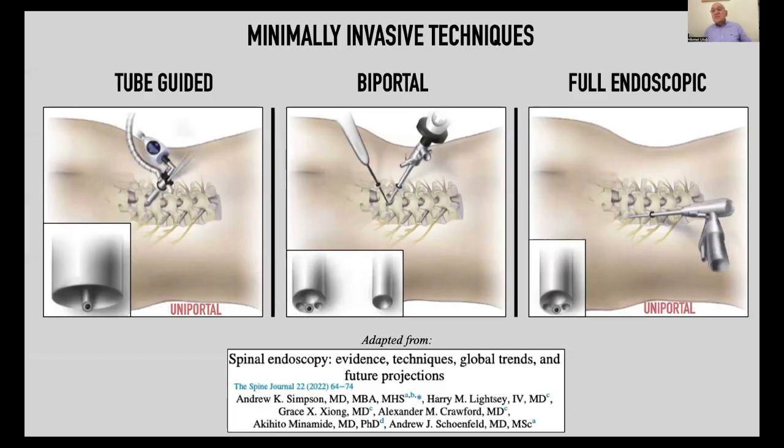All of these techniques are minimally invasive, and they all address the same pathology. We often describe them using portal-based terms: uniportal, monoportal, biportal. But this can be misleading because tube-guided techniques are also uniportal. So the difference is not the portal. The difference is how we reach the pathology.